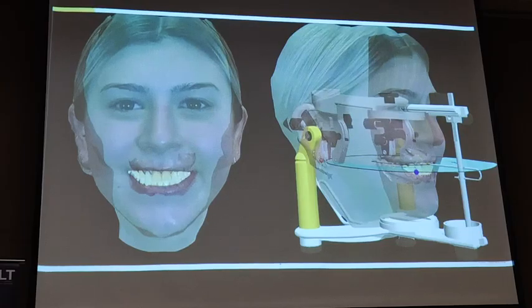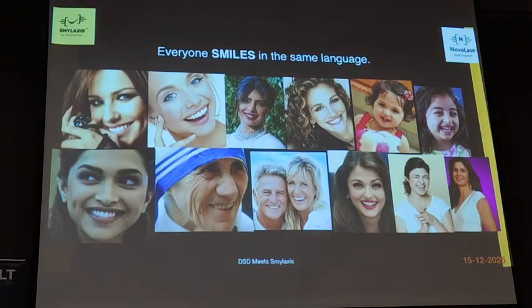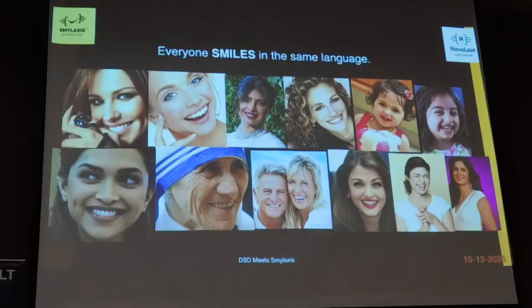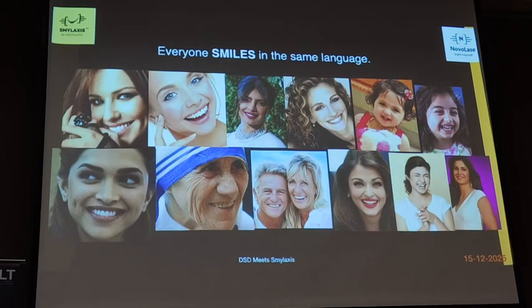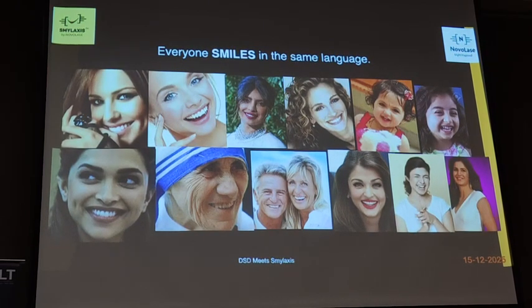Right? So having said that, I'll take you to the basics of digital smile design, because we don't have a language for smiling, right? Everyone smiles in the same language, right? This smile is good, and for others it might look bad. It's all totally customized. But we have certain golden principles, like what exactly the smile should be, how the midline should be, what the smile arc and smile line should be. So just a few basic things I'll try to show you.